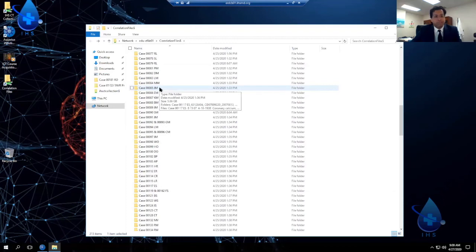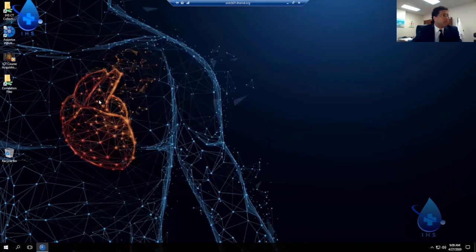Now, when you do a case, if you have an issue with it, if you struggle and can't get it right, can't find it, just write that down. And each morning, as a group, I'll have you call out those cases and we're going to do them live. This is that course acquisition video.